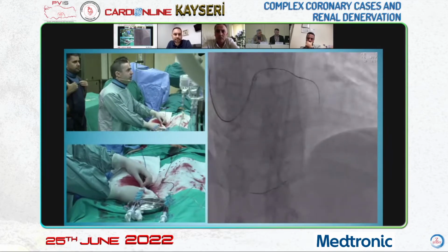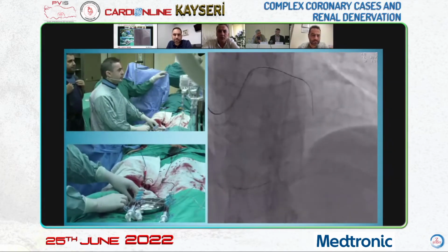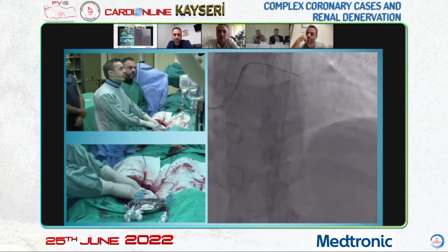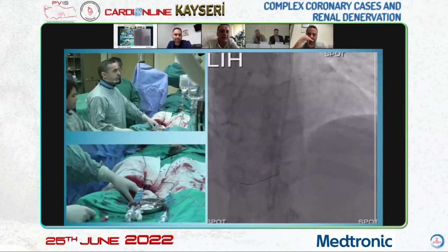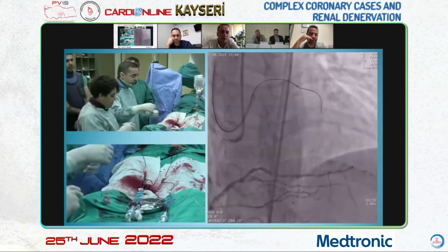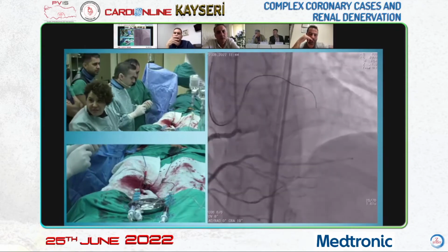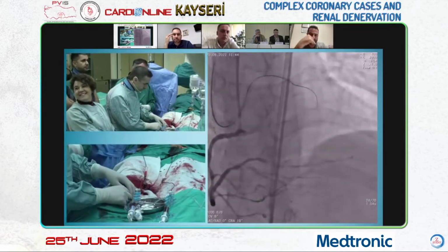Here, would you recommend a step with hydrophilic wire? After this curve, you can do it. Turn around the curve. Do the escalation and seek for the lumen. What's the Micro? Fielder? Hydrophilic wire will ease the subintimal progression.